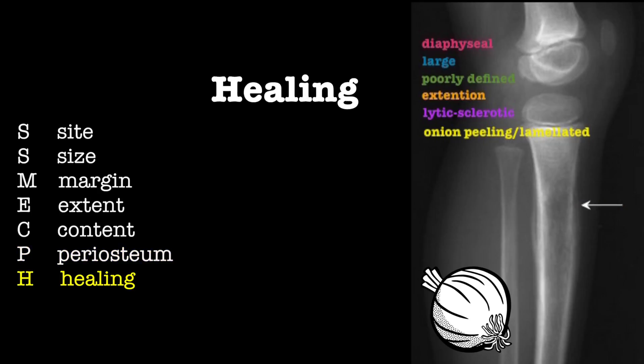H is for healing. Sclerosis and healing of pathological fractures suggest that there is a host response, and therefore indicates a benign process. This is not seen in the above x-ray.